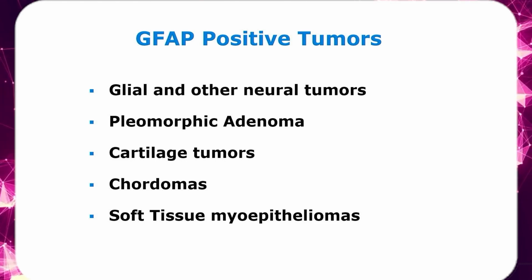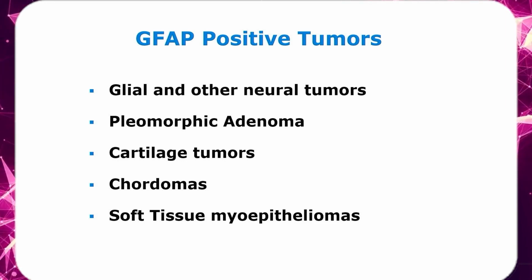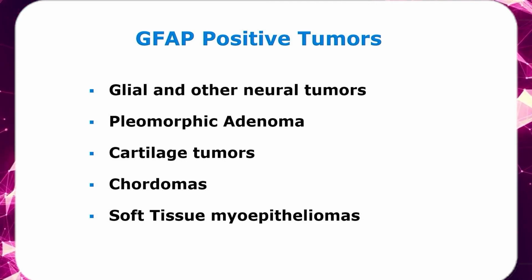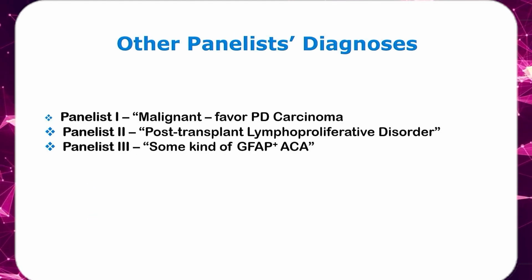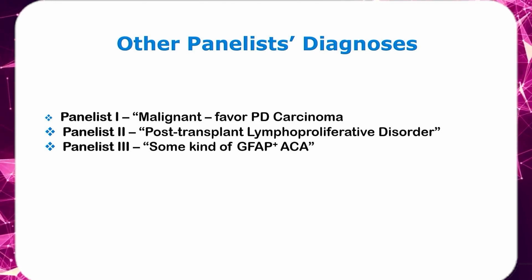So this was a case I actually used. I moderated a session at ASC, and you would remember us if we do this diagnostic slide seminar where we bring 4 expert panelists, and everyone in the audience of 600 plus people has the audience response system. We show the slides and everyone votes on the diagnosis. So I had 3 past presidents of the ASC, American Society of Cytopathology, the most experienced people who evaluated this.